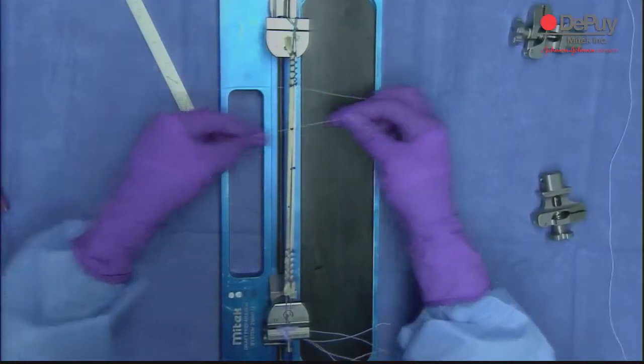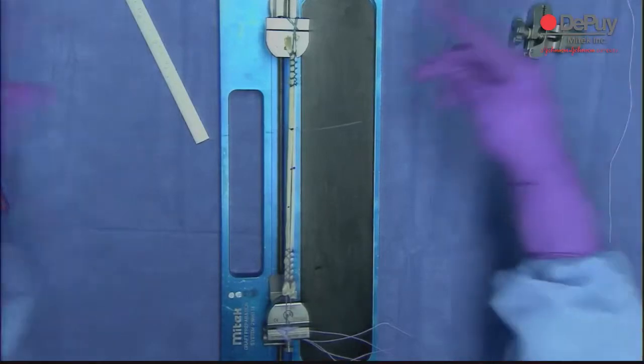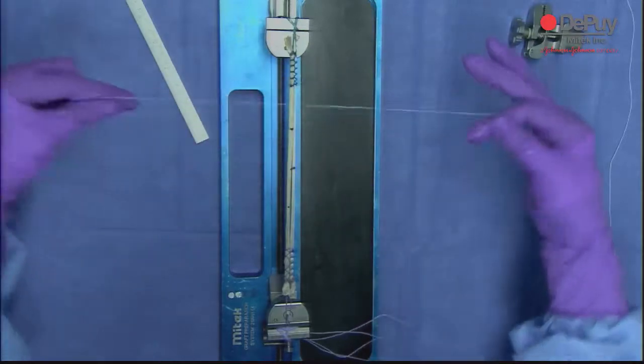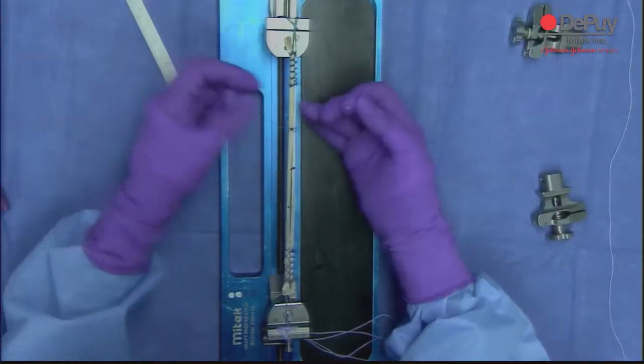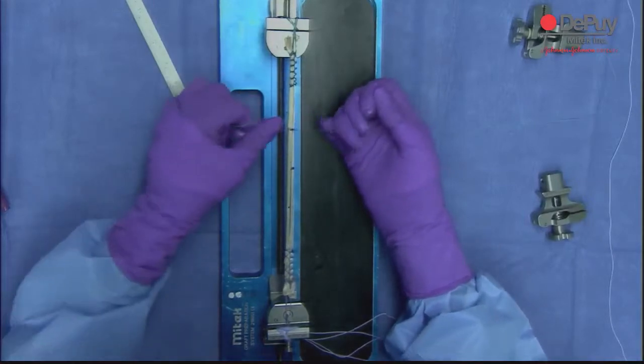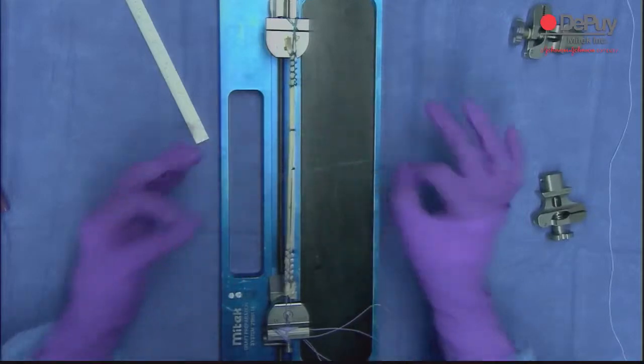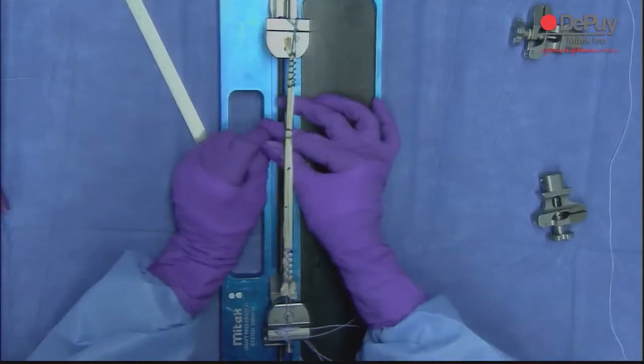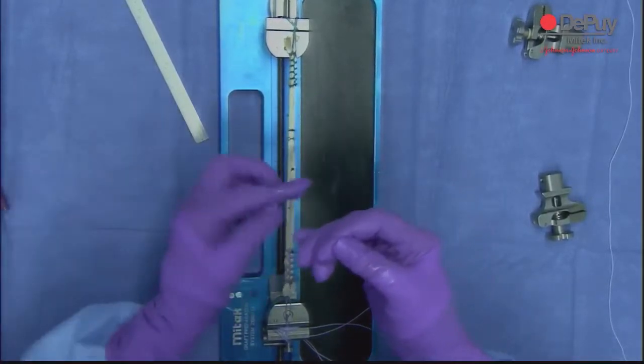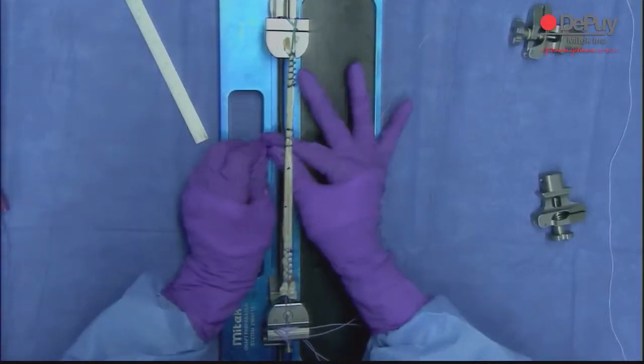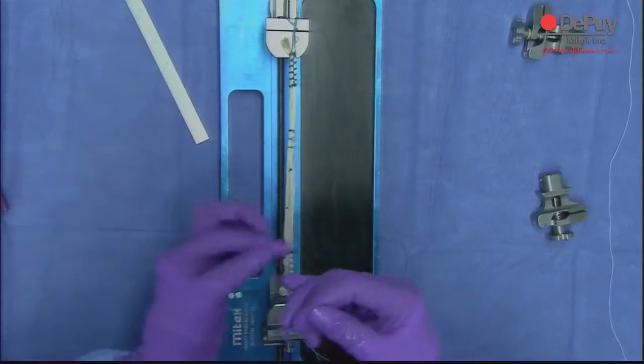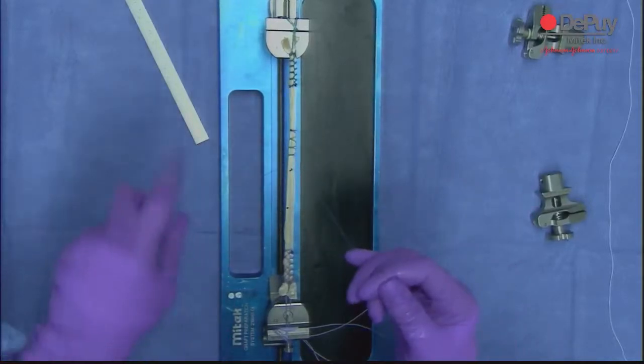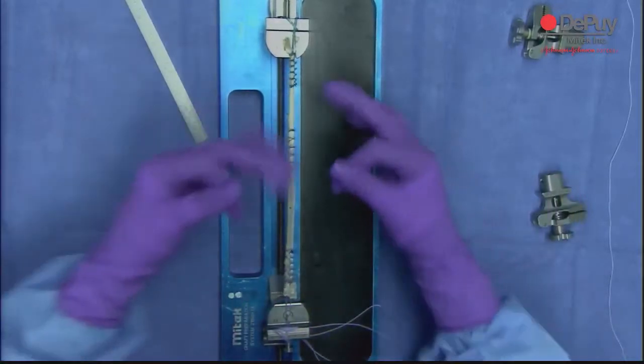Now I'm going to use the same suturing technique. I'm going to start with the green on the end where the green sutures are. Bring this through twice, tighten it down. Now go underneath, on top, half hitch. This time it doesn't really matter how many sutures you put in here. All you're trying to do is gather this together to make a distinct bundle. This will be either your anteromedial or posterolateral bundle. So you can get away with three or four, maybe five stitches at the most.